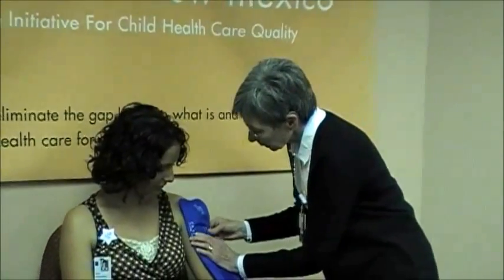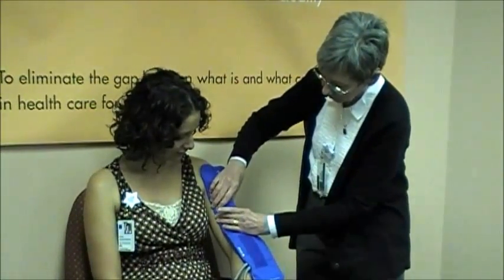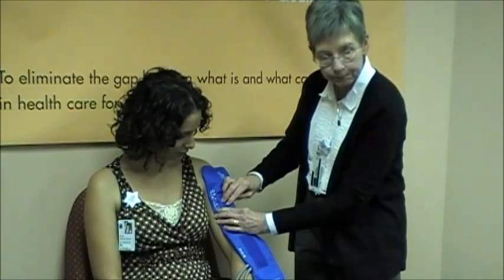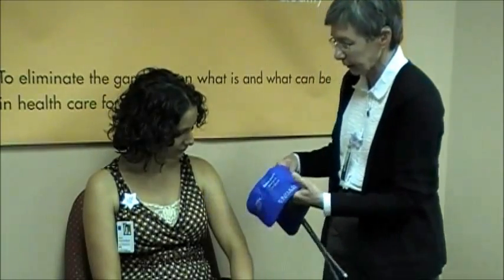There are several ways to visually do this. One way is to compare the bladder width to the arm circumference. In this case, for a cuff to be an appropriate size, bladder width should cover at least 40 to 50 percent of the circumference of the arm. It clearly doesn't for Kirsten with this cuff.